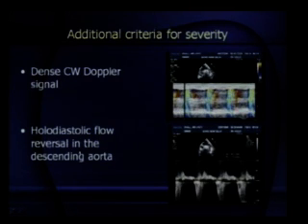We are showing you the picture here of where the beam is placed, and this shows you the systolic envelope, and here is the diastolic envelope. So mind you, you have to be pretty good at knowing which way the flow is going to get to know about flow reversals.